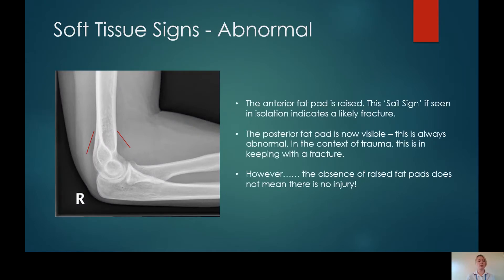This is an example of abnormal soft tissue signs. As you can see, the anterior fat pad is displaced away from the distal humerus by about 45 degrees — we can describe this as the sail sign. In the case of trauma, this very likely indicates a fracture, although not definitively so. We can now appreciate the posterior fat pad, and as previously said, it is never normal to see it. In the case of trauma, this is always indicative of a fracture, even if you can't see it — what we would describe as a radiographically occult fracture, where there is a fracture present although you just can't appreciate it on the radiograph.